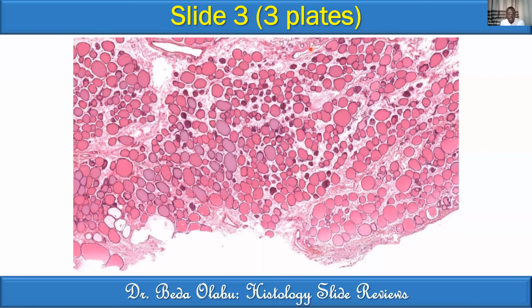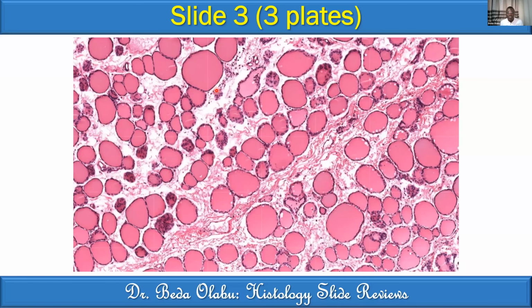And what both of them picked is that at this magnification, we can see follicles, because we can see follicular morphology. Follicles of varying sizes. These follicles are either spherical or ovoid, and that is ovoid, and perhaps that one is spherical, of varying sizes. We are able to pick that at that magnification. Then going to second level magnification, we confirm what you've seen in the previous slide.